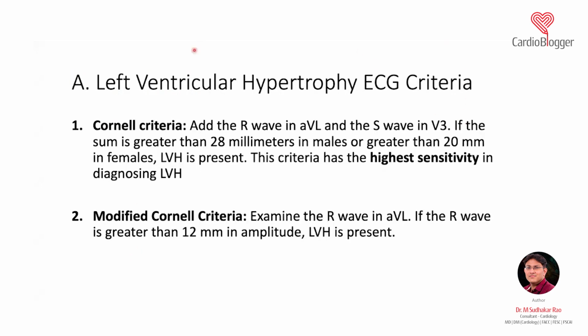Now again, I'll just stop. I think I should answer the question which I had there. So which is more severe? Now I don't know, the question is about the severity by ECG or severity by clinically. So if you have a RVH, both ways it is worse. It depends on the diseases which are causing this.